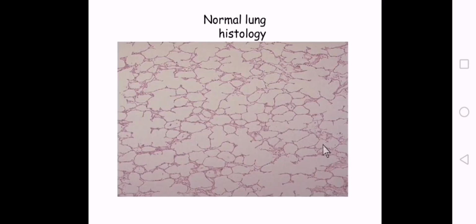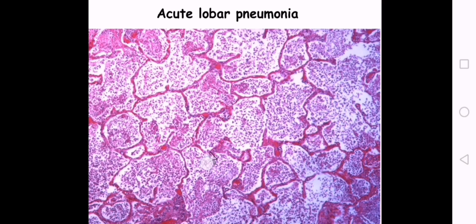هذا الكلام اللي حكيت عليها grossly. فالdiagnosis grossly هو acute lobar pneumonia. This is a normal histology of the lung, thin-walled alveolar wall, وأكو space للexchange of air. If you compare it with this slide, شنو اللي أول شي تشوفونه؟ أول شي تشوفونه إنه الlumen filled with inflammatory exudate. هاي الانفلاماتوري exudate جاية من الإديمة fluid، جاية من النكروتيك debris من الوول، جاية من الانفلتريشن by polymorphonuclear leukocytes.